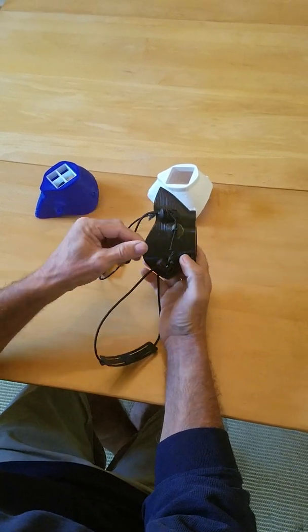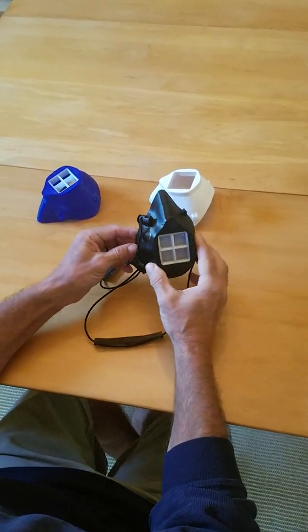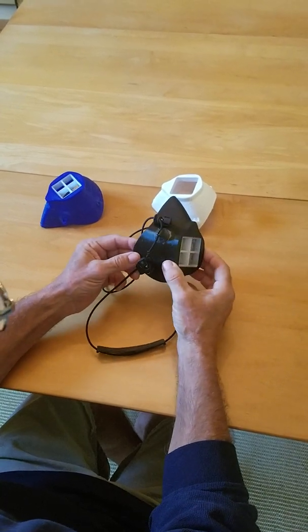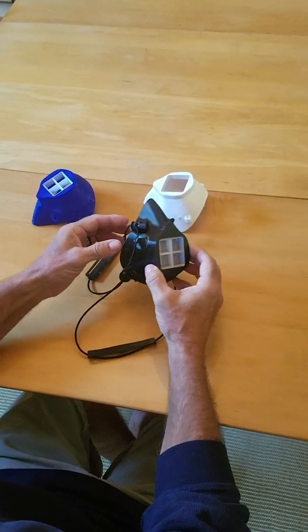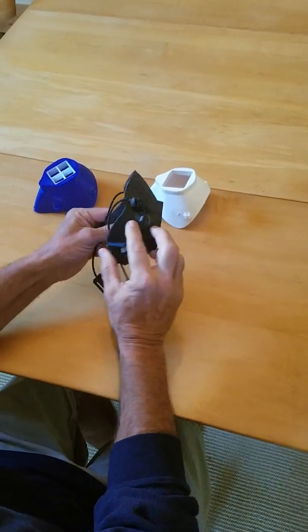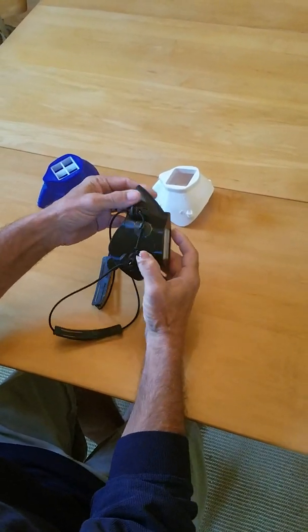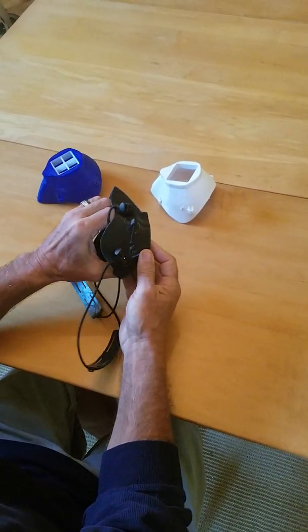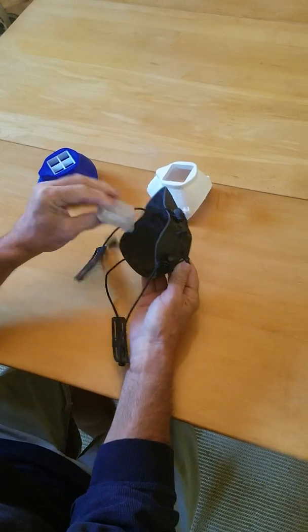Design. This was not designed by me. It's a shareware mask for health professionals. And so let's go through some of the characteristics. It's flexible and soft. It has a filtration cartridge, and it just pops in and out like this.